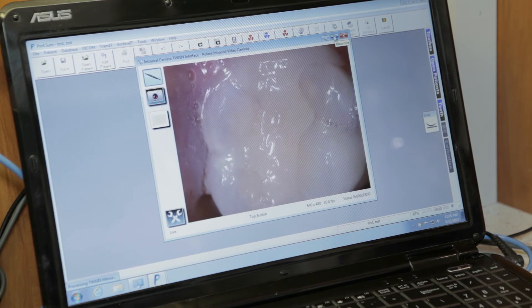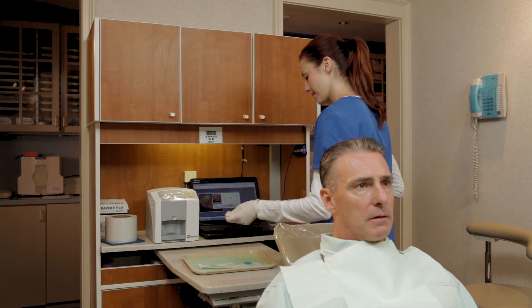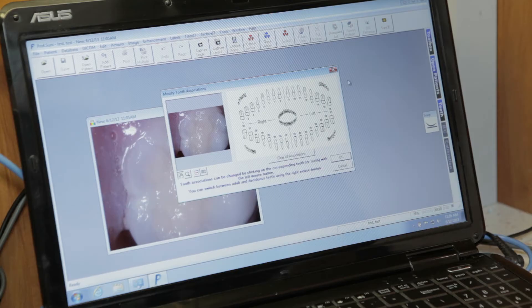Depress and release the button on the bottom of the camera to save it. Once you've saved the image, the camera automatically goes back to live mode so you can continue your exam. When you're done, turn the camera off by depressing the power button. Dispose of the sleeve and save the image to the patient's record.